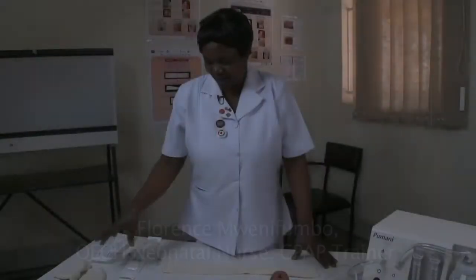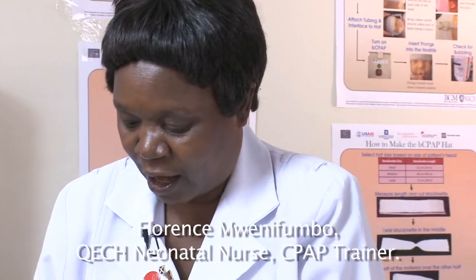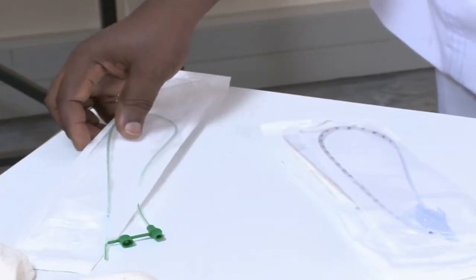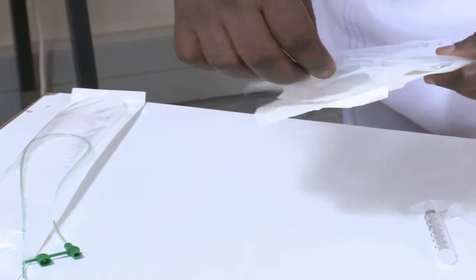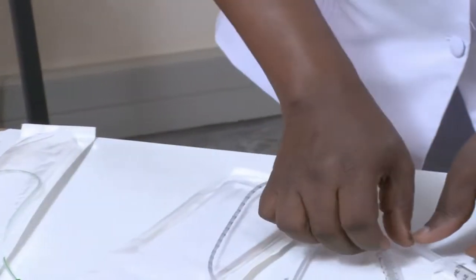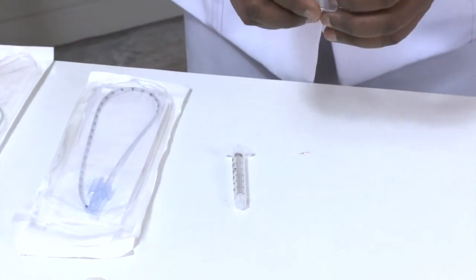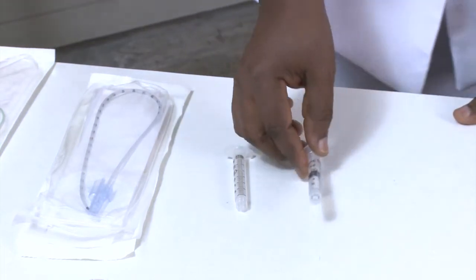On my table here, I have the things that I need to put a baby on CPAP. Here I have the OGT. This is the tube that I'm going to put in the mouth for feeding, and I have a tube here for suctioning. I have my feeding syringe here that we're going to use for feeding the baby. And I have saline on my syringe to moisten the nostril of the baby.